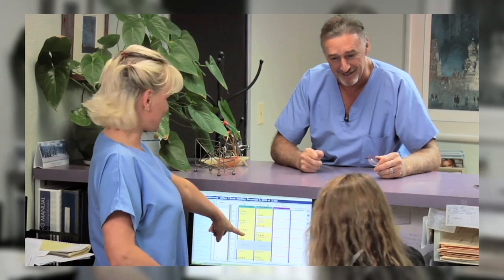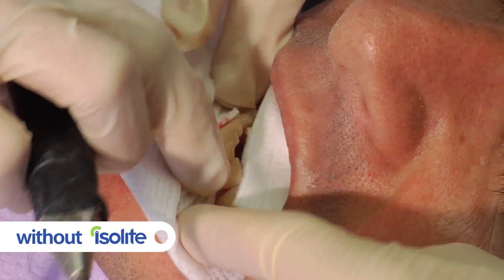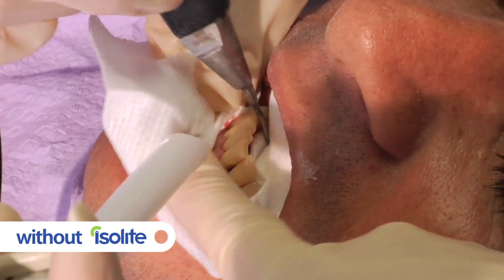When you really think about standard four-hand dentistry, a number of challenges emerge. The tongue is in the way, hands are in the way, suction is in the way.